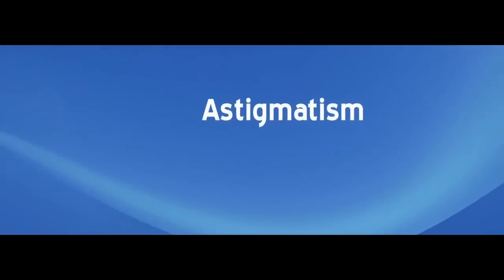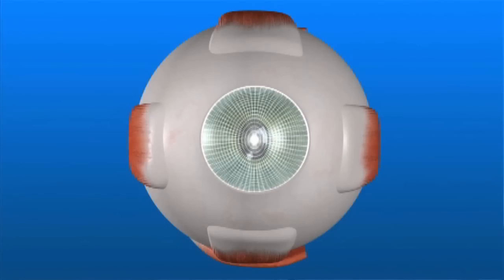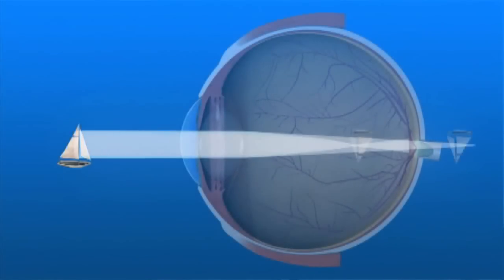So it works perfectly. If your cornea is not perfectly rounded, it produces a natural blur called astigmatism, requiring you to wear glasses or contact lenses to see clearly. Astigmatism is not corrected by cataract surgery alone. If you have astigmatism and a traditional monofocal lens is implanted during cataract surgery, you can have excellent vision with eyeglasses. However, if you want better vision after cataract surgery without having to wear glasses, your ophthalmologist may treat the astigmatism by making tiny incisions in your cornea, called limbal relaxing incisions.